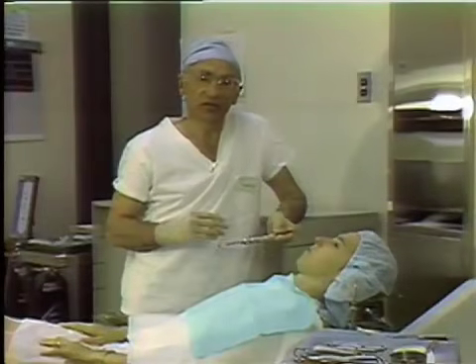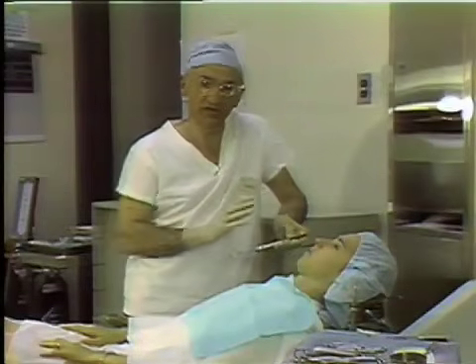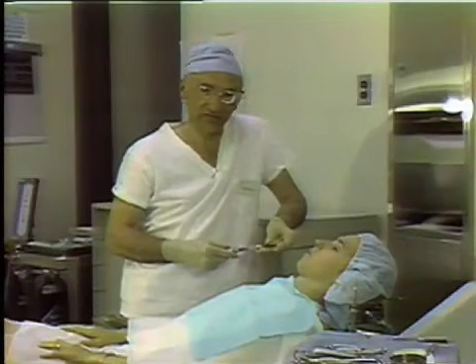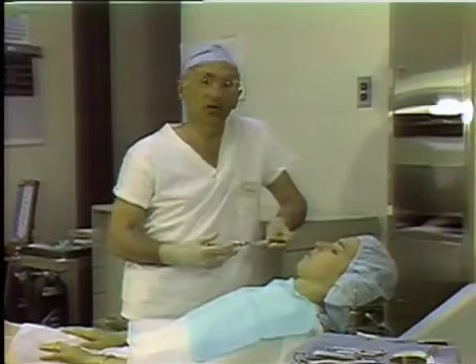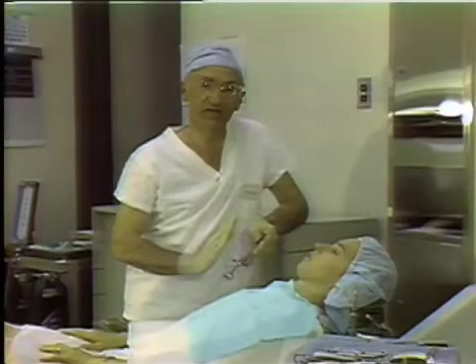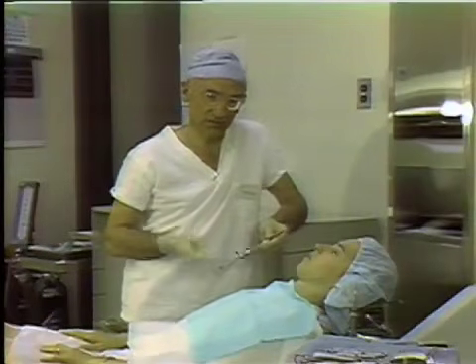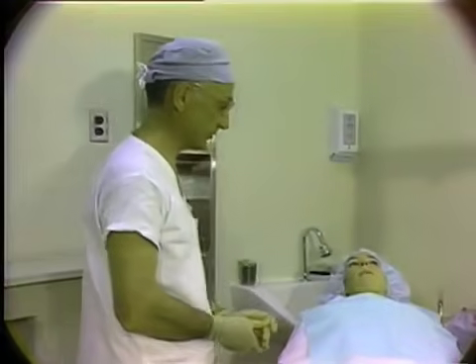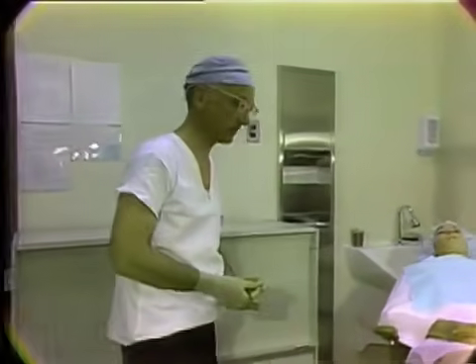So it's not only for keeping the local anesthetic just ahead of your work for maximum effectiveness, but also the aspect of the volumes of local anesthesia that are administered. We don't want to administer a large volume of multiple injections all within a short space of time, because when we do this, we increase the potentials for toxic reactions to local anesthesia. The instruments for a specific procedure are built upon a basic set, and they should be thought of from the beginning of the first incision to the placement of the last suture.